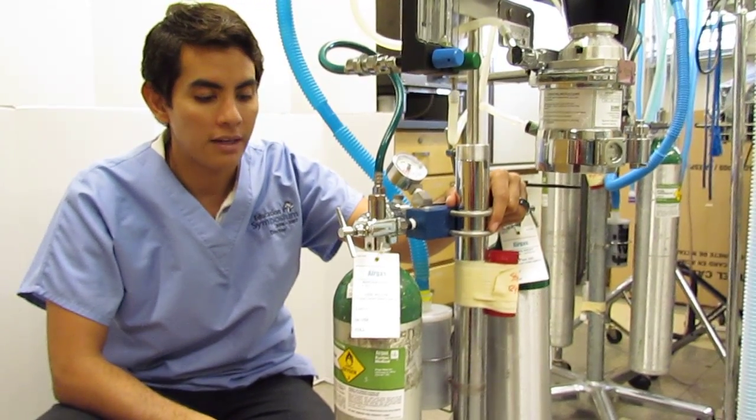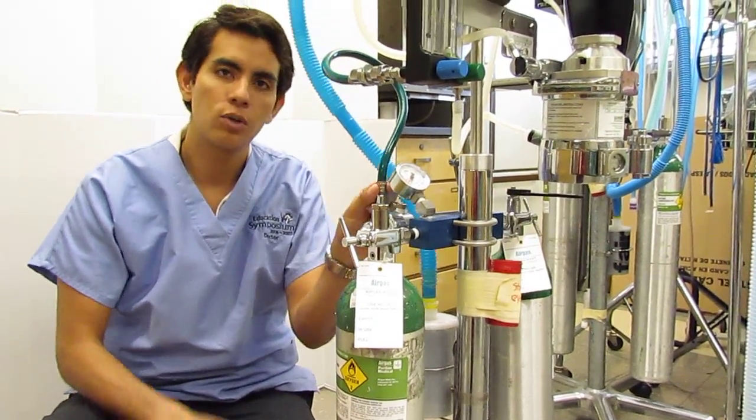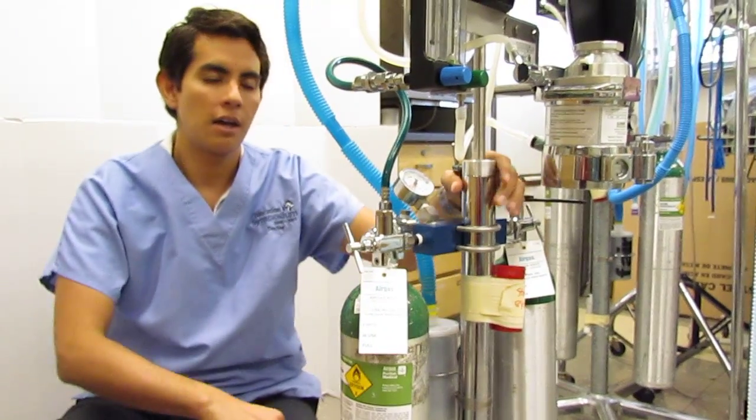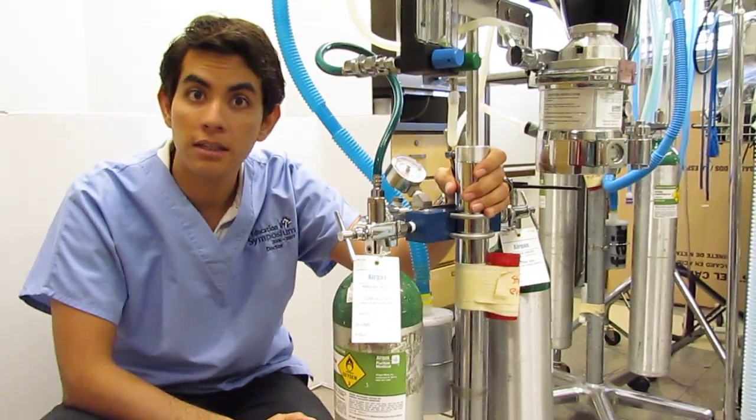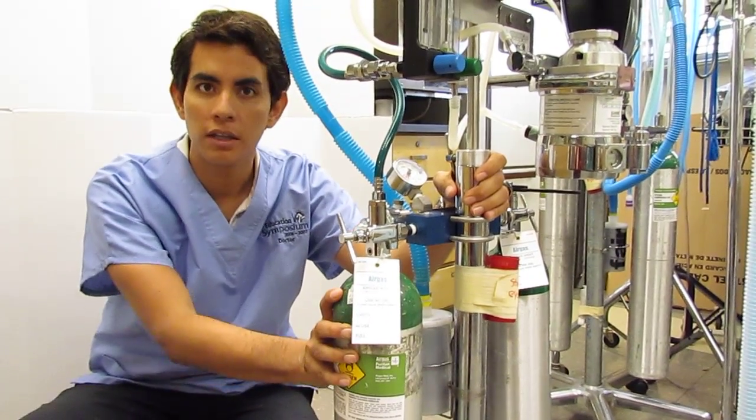If we had an H tank setup, this hose would connect directly into one of those connectors in the room coming down from the ceiling. We don't have that setup today, so we're going to be working off the E tanks.